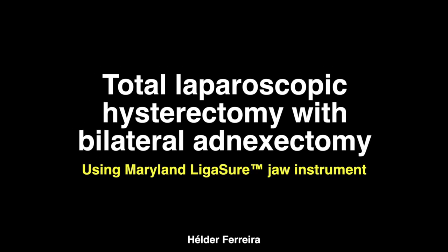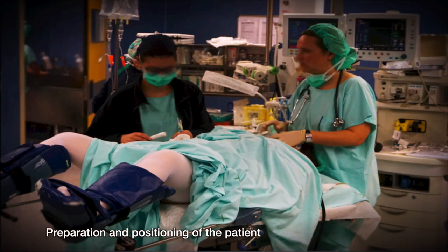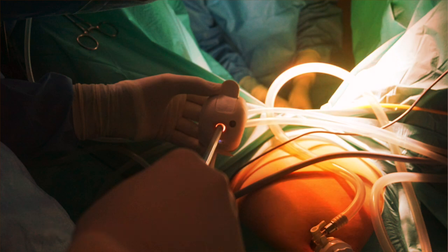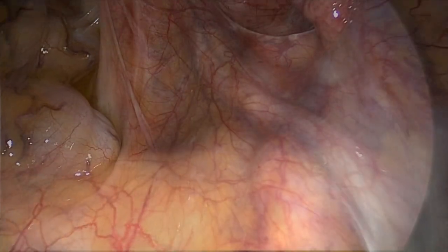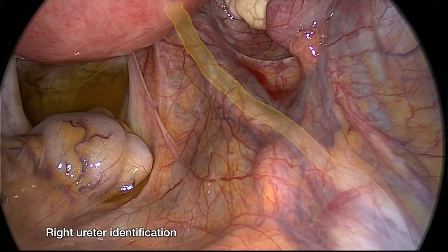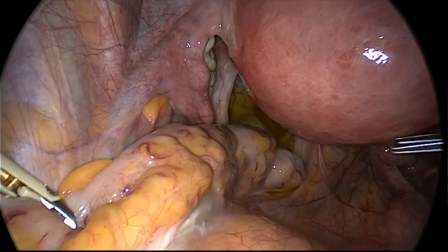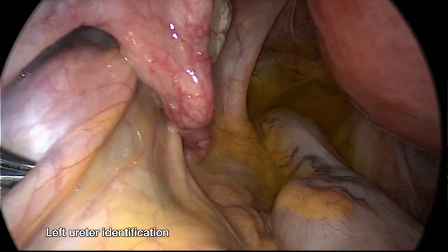In this video we want to demonstrate a total laparoscopic hysterectomy with bilateral adnexectomy using a Maryland LigaSure device. We started by positioning the patient, and we used the direct entry technique with an optical trocar. After cleaning the optic we use the Clarify system, and as always we try to identify the anatomical landmarks like the ureters.